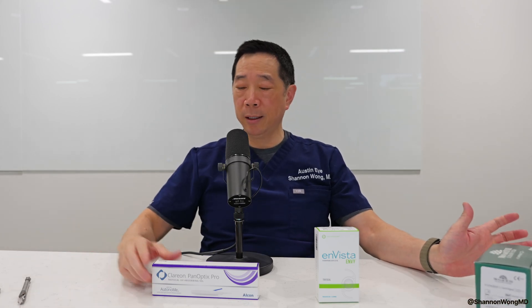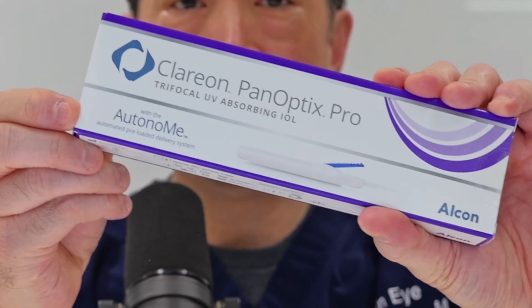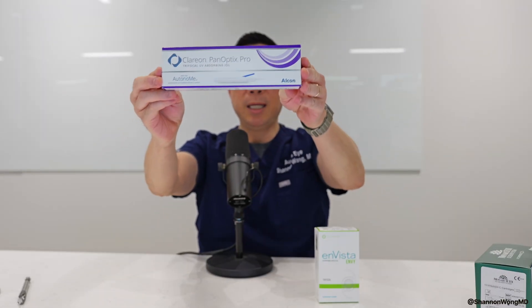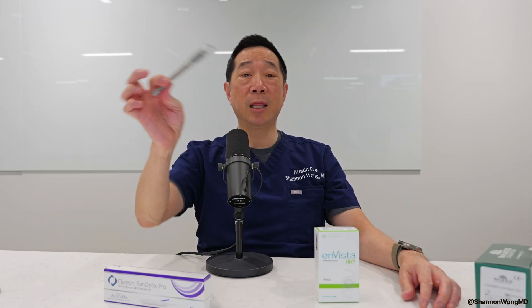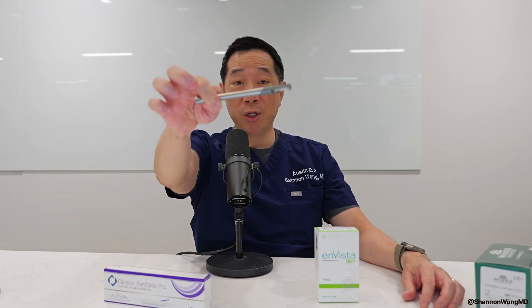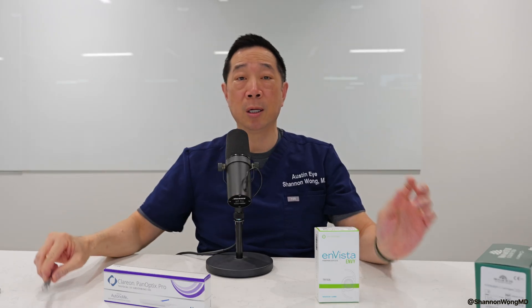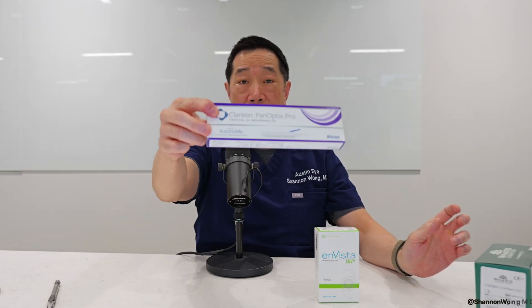On the other hand, the autonomy system, which is used for the Panoptix Pro lens, it doesn't work quite as well. And I'm going to show you some examples of how the Monarch 4 injector with the Monarch 3 cartridge works compared with the autonomy injector.